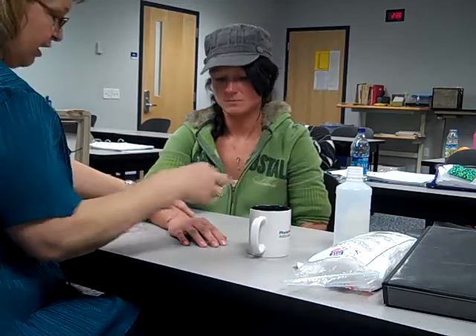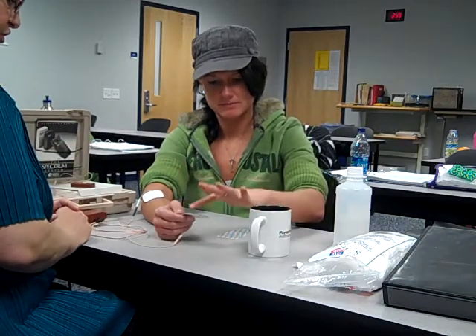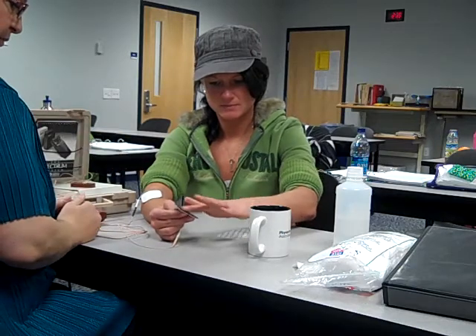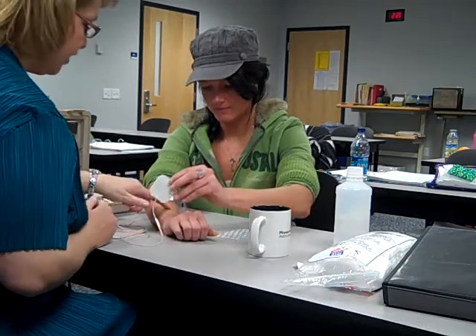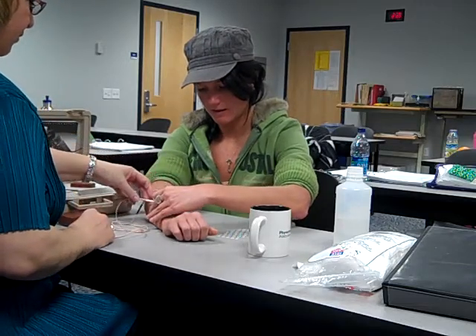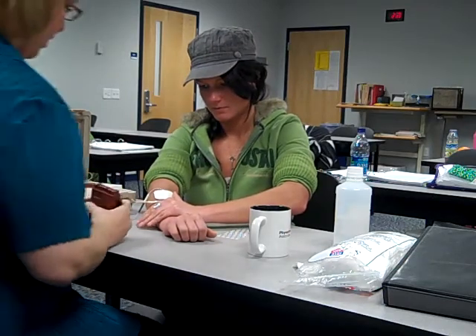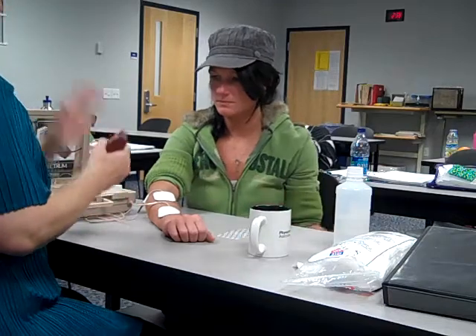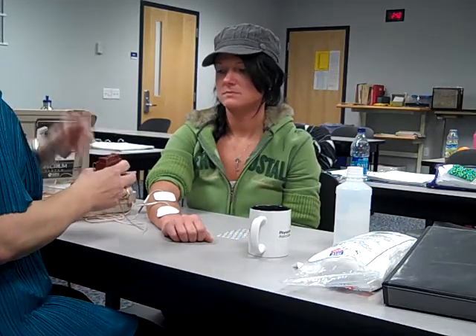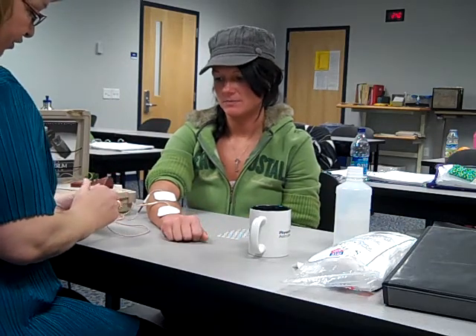I'll have you put the other electrode on — just a drop of water, get it all over especially around the edges. Make sure that tail is going up the arm. Hold it for 15 seconds. Everything is turned off right now. I already have the rate set at 100 for high rate and the width at 50. Those are set where I want them to start. We always want to start with those two numbers for high rate. I'm going to put the lead wire back into the port.